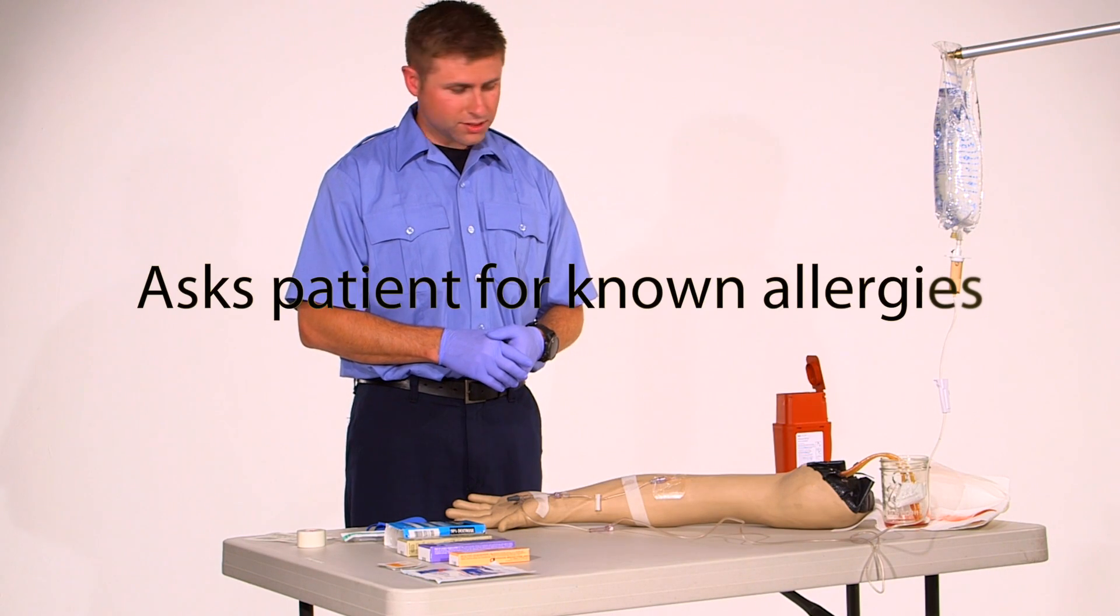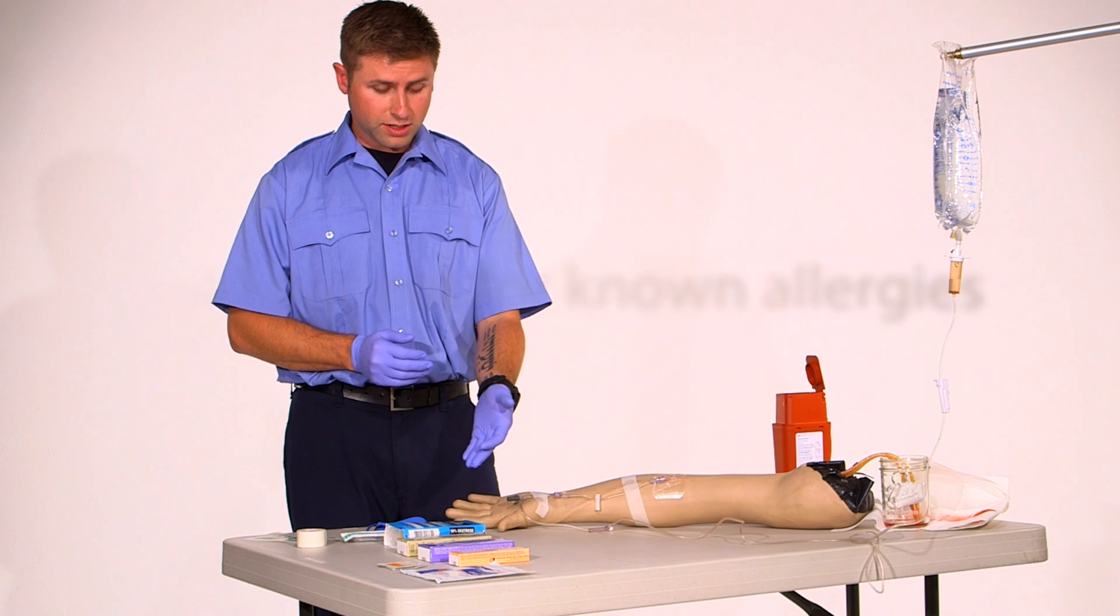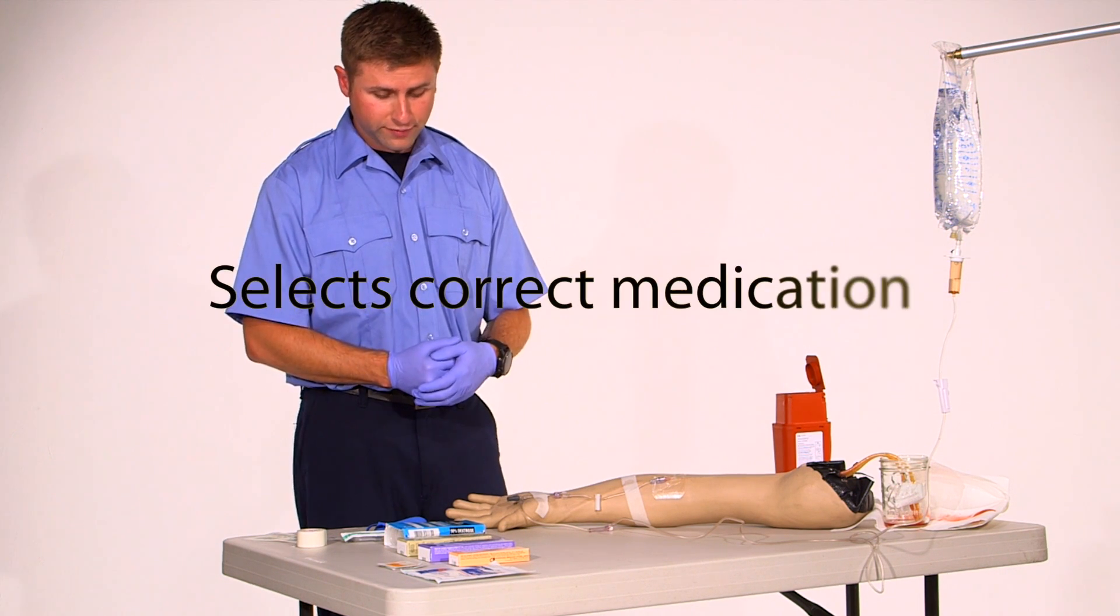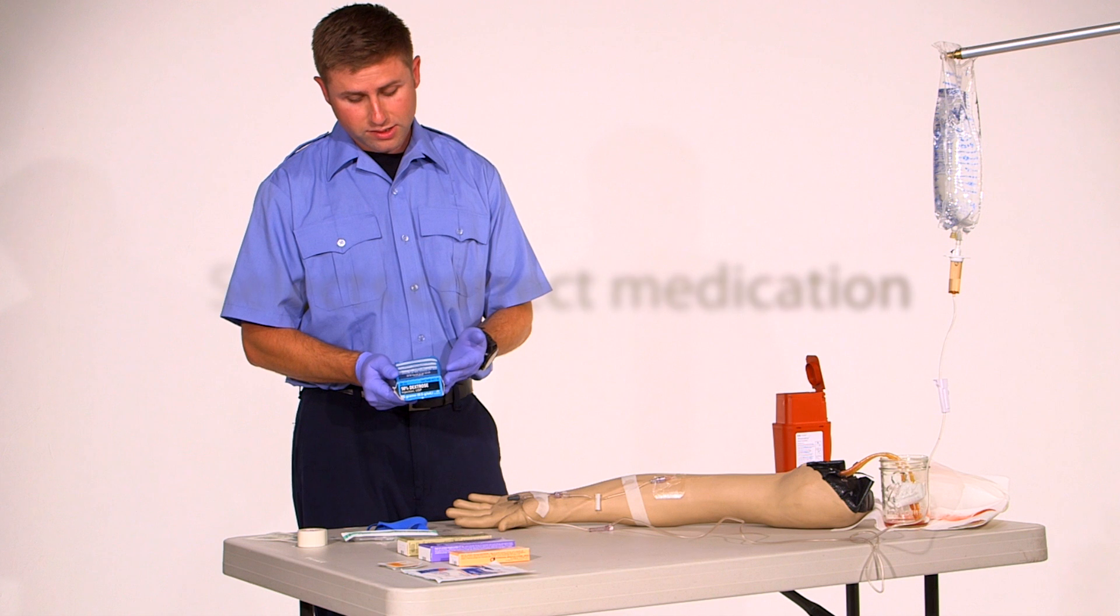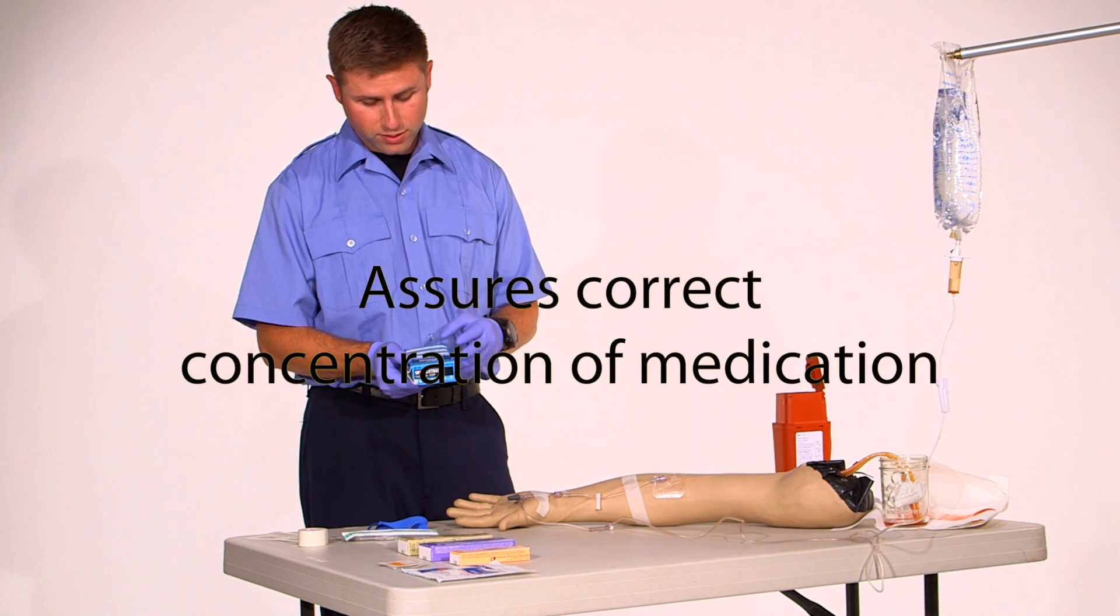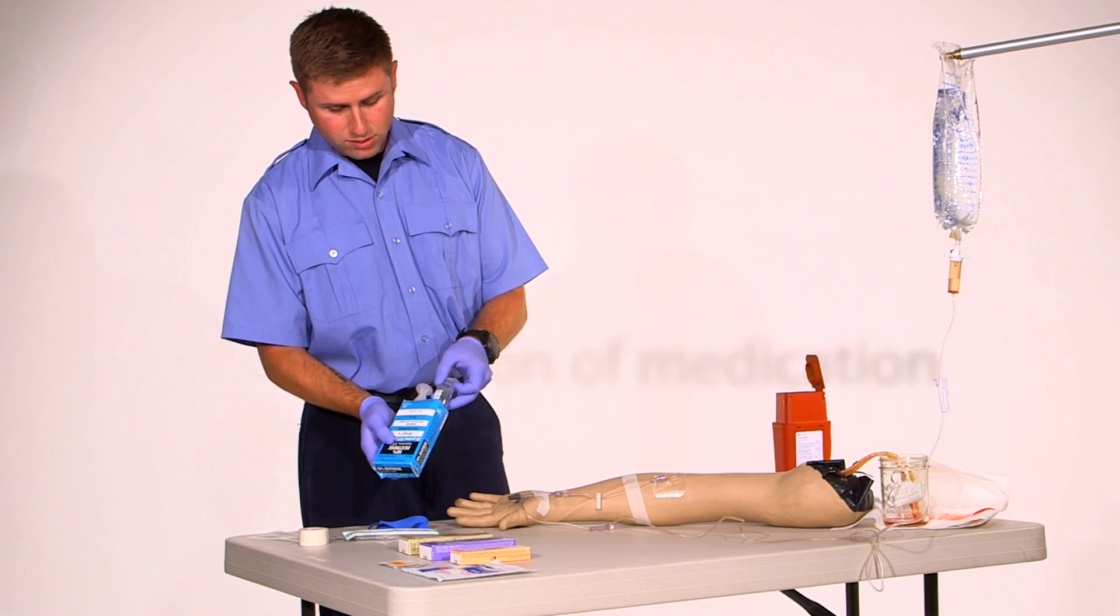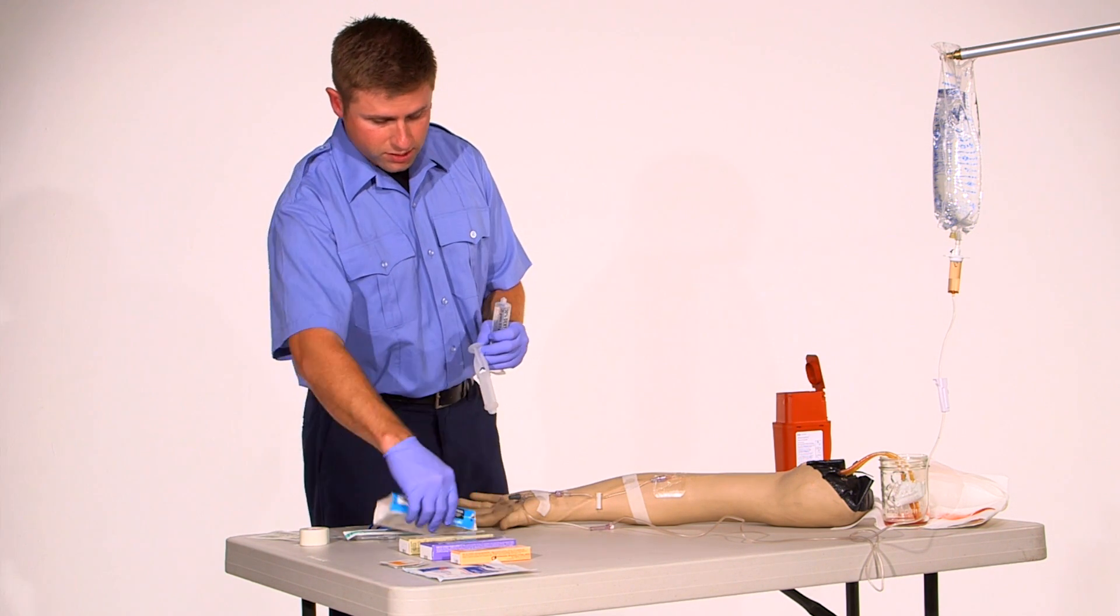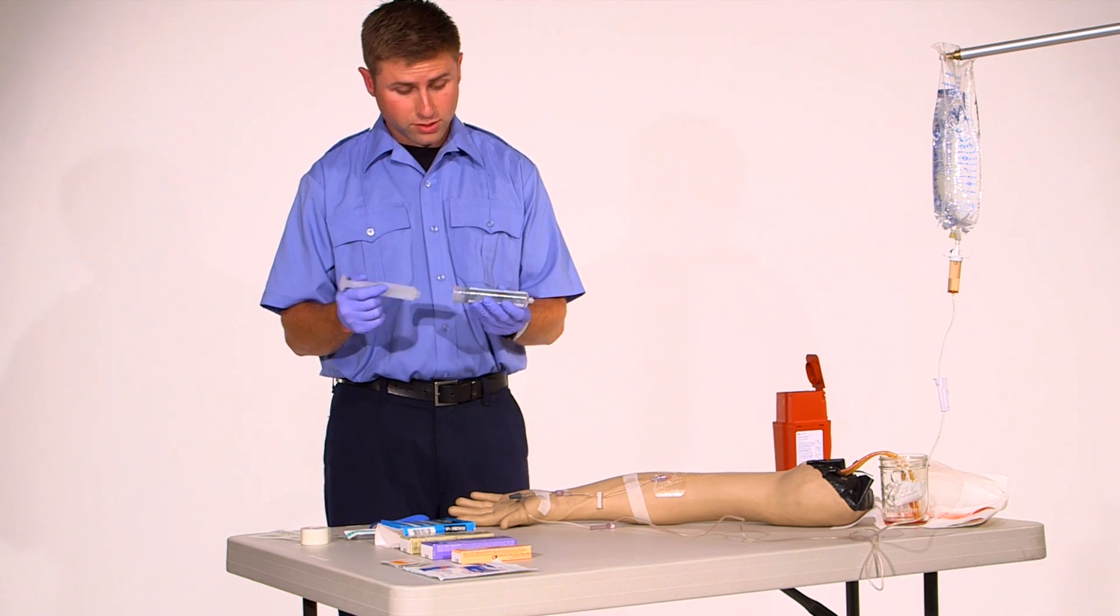I'd ask the patient if they have any allergies. If they don't have any allergies, at that time I would select the dextrose 50% or D50. I'd grab the D50 and make sure that it is in fact dextrose 50%. It's the right dose, right drug, right date. The clarity is good on it. There's no leaks or anything like that.